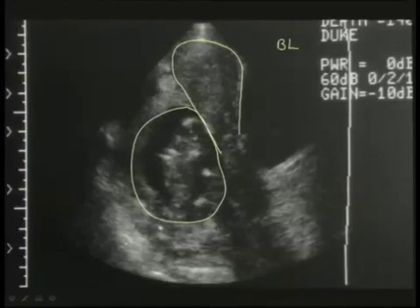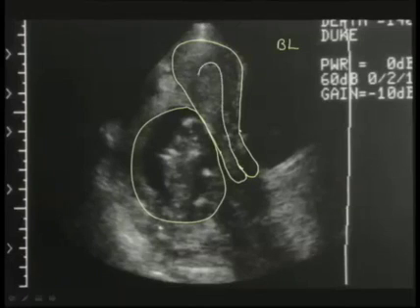What's important about this diagnosis is the identification of the uterine cervix. So the way you would diagnose this is that you identify the uterine cervix and follow the endocervical canal up into the uterus, and that will show you that this is outside the uterus and not within it. So it's very important to always locate the cervix and be very clear how the endocervical canal joins the endometrial cavity.